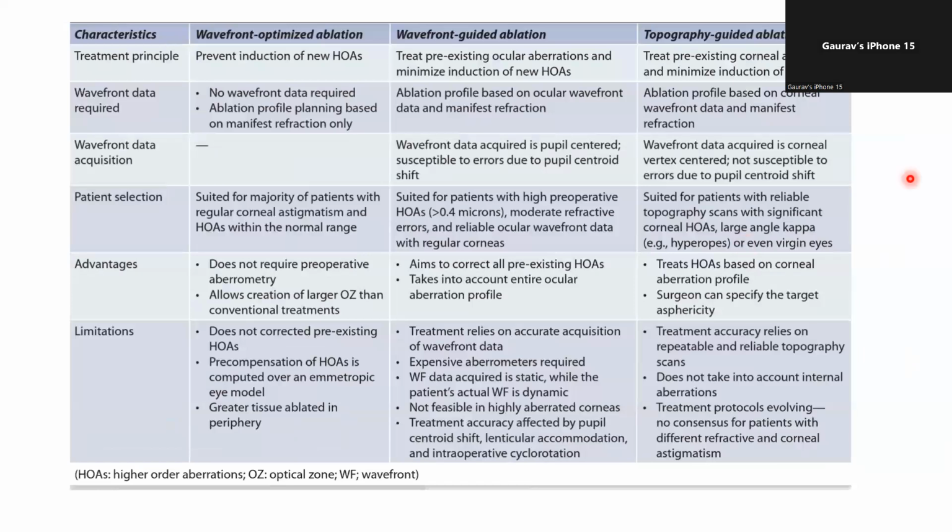So apart from the conventional ablation, which induced a lot of glare, halos, and a whole lot of problems, scientists developed 3, 4 more additional patterns of treatment, which were based on various diagnostic equipment. First came the wavefront optimized ablation, then wavefront guided, and then topo guided.